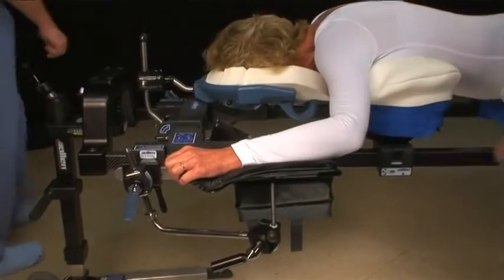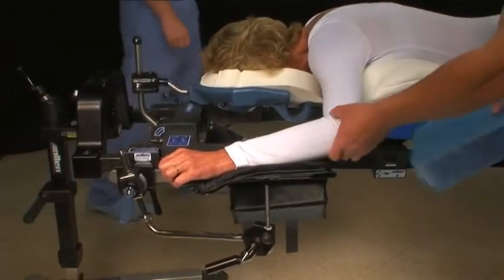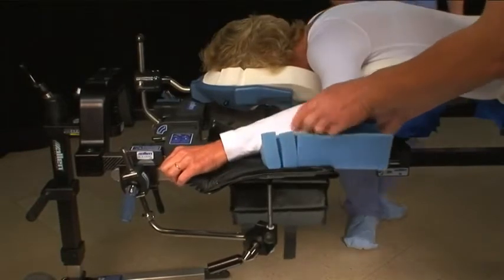Check that the ulnar nerve is free from pressure. For extra protection, you can add foam under the patient's elbow.